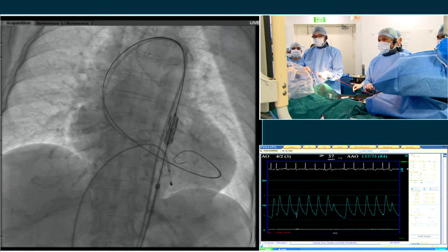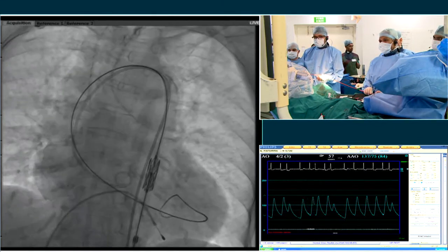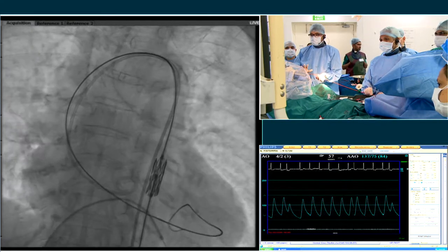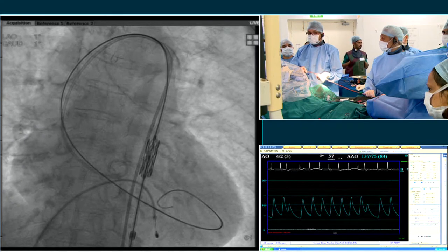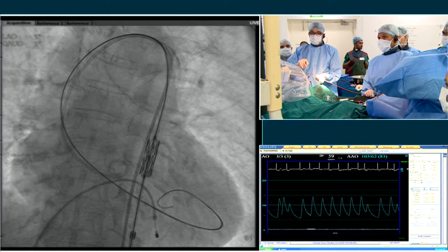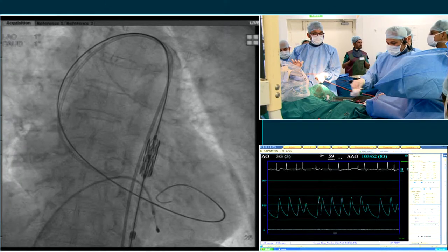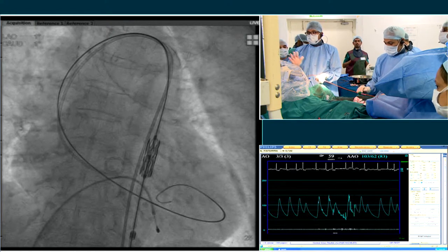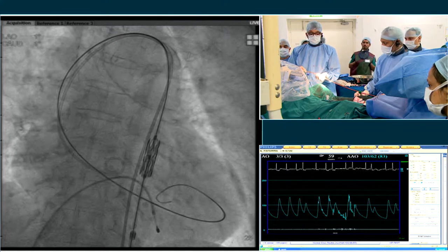Okay, let's stop there. You can go in LAO, but here the aorta is pretty well laid out, so we'll stay in this view. I'm going to start flexing. We have a minute. So pressures are stable. We have about 5-10 minutes left in this transmission, so take our time here. Pressures, in any of these procedures, whether after the balloon, what I didn't mention is we always look at pressure. Sometimes you can create AR, and that tells you the pace at which you have to do this procedure. If the patient becomes hypotensive, you've got to start moving quickly.